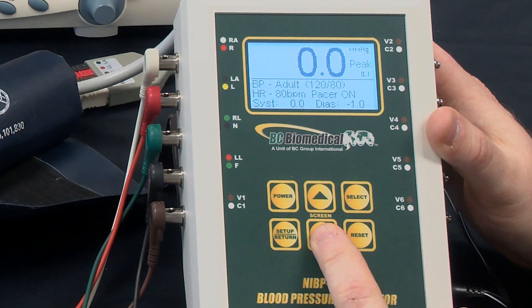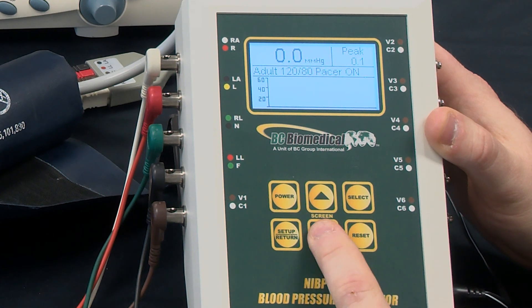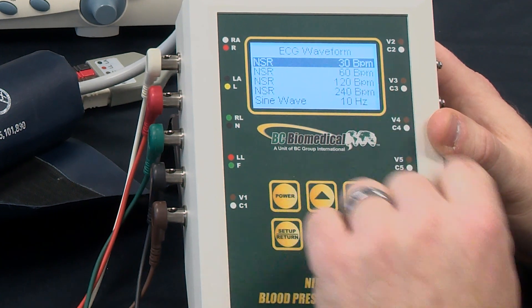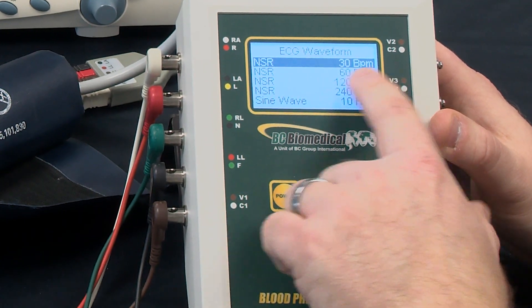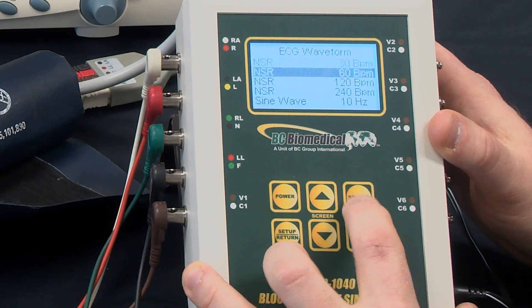We'll demonstrate the alternate modes. If we press the screen down button that will allow us to select the different screens available on the NIVP. Going down three screens we can see we're in ECG mode. These are the performance waveforms we would use to test the monitor, where we can select normal sinus rhythm and select the heart rate we want to use.